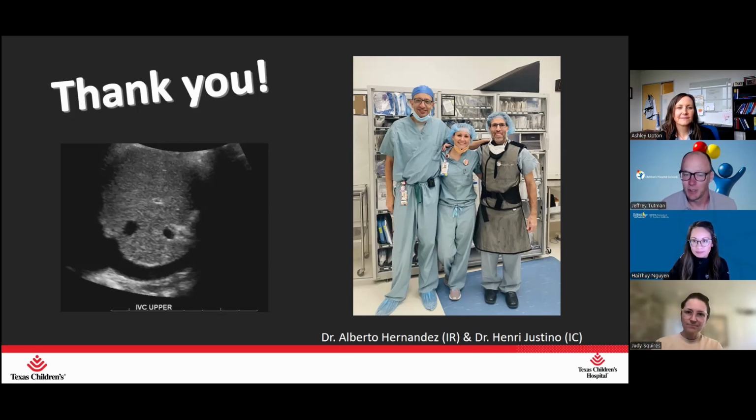So even in those patients, we use it almost as an internal control. I forget the exact numbers. I think it's less than 4.7 kPa that we say is probably normal, and if it's more than I think either 14 or 15, we say that's probably fibrotic. But we give that caveat and, like you said in your talk, interpret in the clinical context of the patient rather than strict values of this means this patient has whatever abnormality.